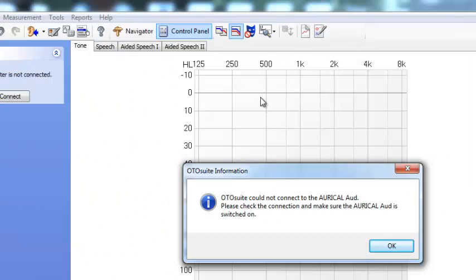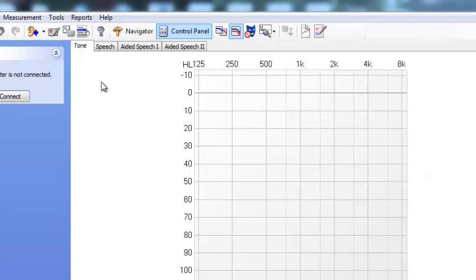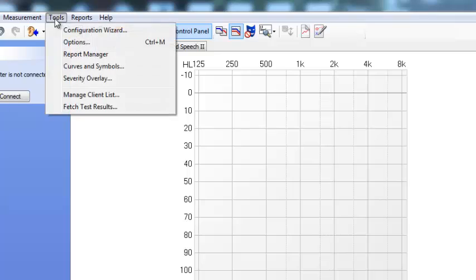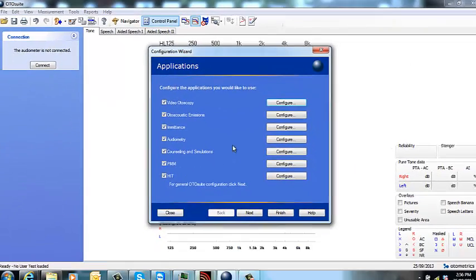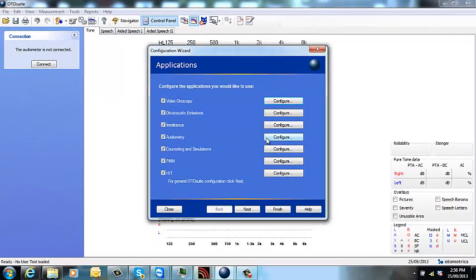You'll then get this error message which tells you that OtoSuite cannot connect to the Aurical Aud. You just click OK and go to Tools, Configuration Wizard, Audiometry and Configure.